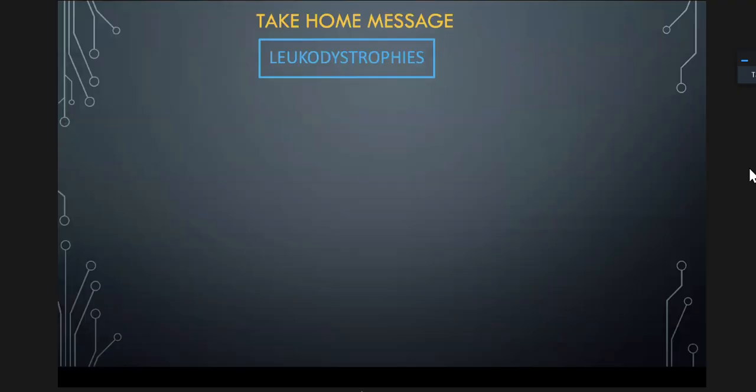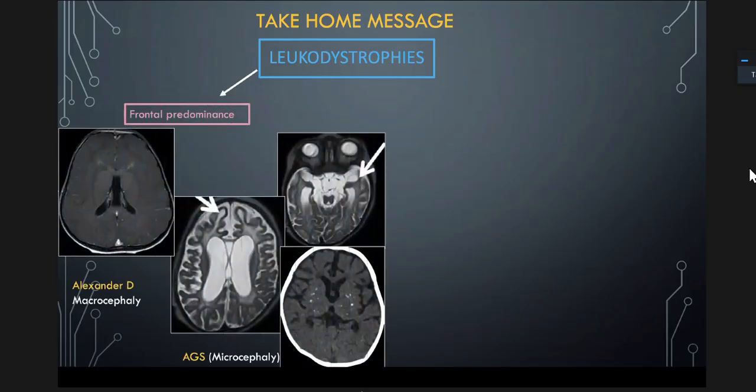Now, coming to my last few slides. So, take home message. I would just want to revise what we did. So we saw leukodystrophies, we saw frontal predominance. Now, in frontal predominance, we saw Alexander's disease. Here, the clinical history important is macrocephaly, and also look for these periventricular rims, which are dark on T2 weighted images, and these will show enhancement.